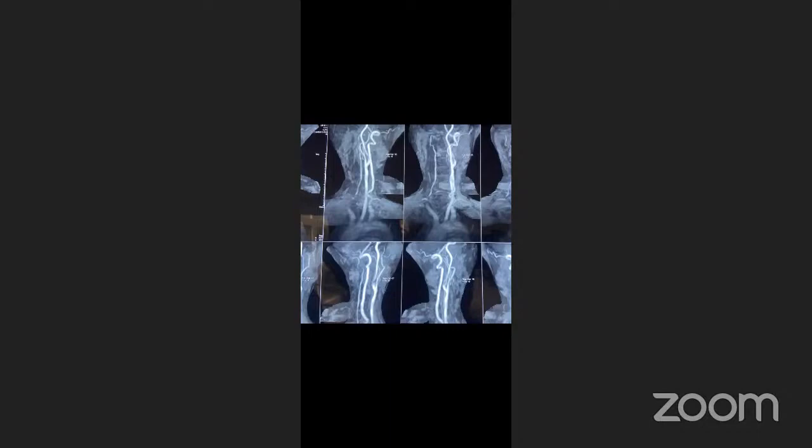So probably he is getting some hemodynamic decompensation of the chronic lesion, which is the right total occlusion and left ICA stenosis. Is that the culprit? Then we have to rule out the right subclavian, brachiocephalic. That could be the culprit, because the left vertebral is so prominent, the size of the left vertebral is nearly equal to the ICA. You can appreciate that on MR.